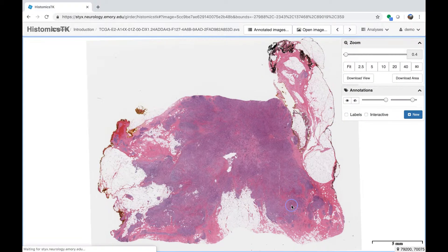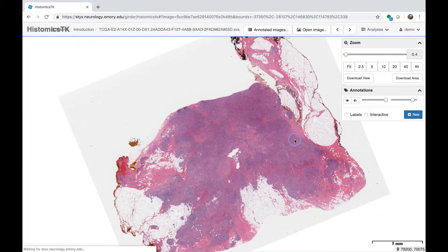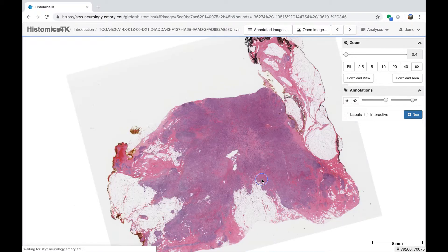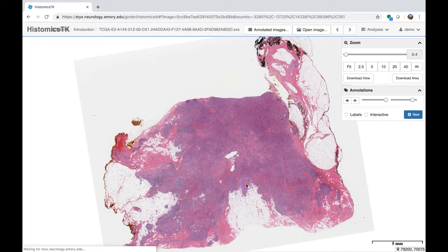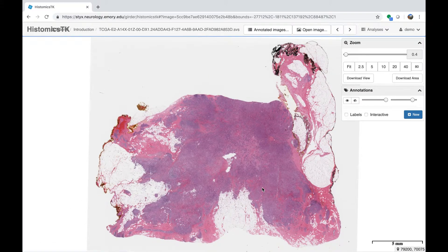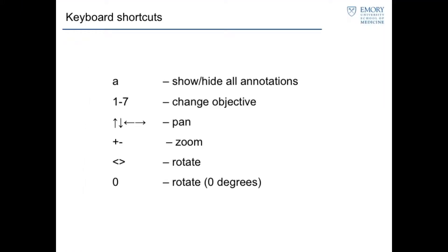If you hold Control, you can rotate the image, which can be helpful for annotations. Sometimes you're working inside a rectangle and the content isn't aligned with the slide, so you can rotate and draw the rectangle at an angle. The Digital Slide Archive also has keyboard shortcuts — you can use the keyboard to show and hide all annotations, change the objective for panning, zooming, and rotation. More keyboard shortcuts will be added in the future.